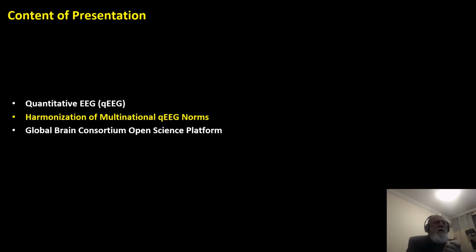Okay, so now I want to speak to the point of what do we do if we want to do multinational quantitative EEG norms. I'm taking this as a very simple example because it already poses several challenges. Among the challenges are, how do we get people to share data? The second problem is, how do we harmonize the differences between countries? Let's say that there may be ethnic differences, possibly. There may be problems of different levels of nutrition, and in studies that we did in the late 70s and early 80s across Latin America, the single most important factor that determined changes in the EEG spectra was socioeconomic status. And then we have the problem of differing amplifiers, electrodes, and so forth.